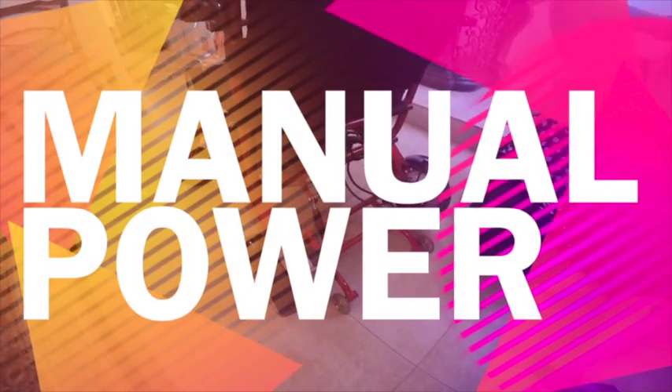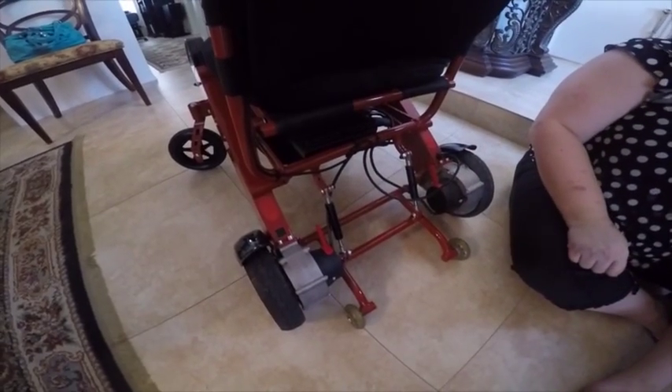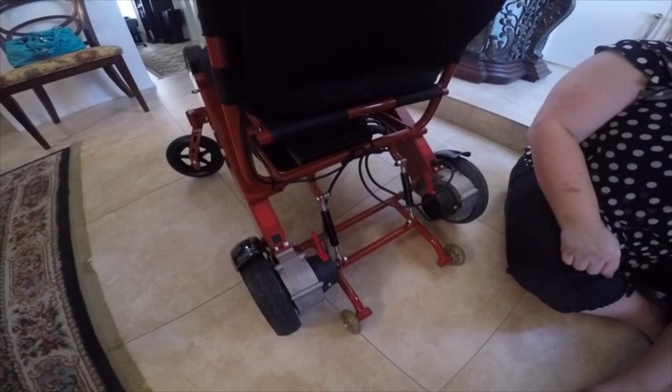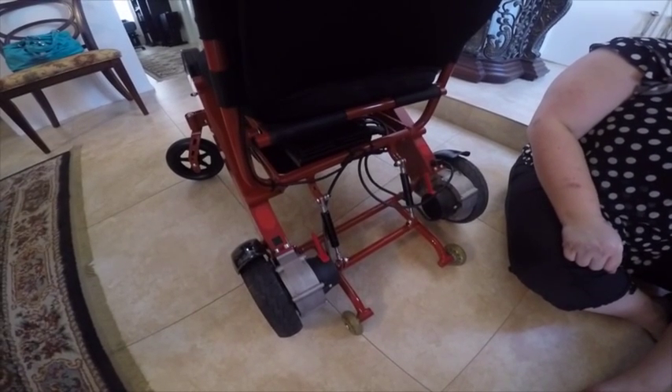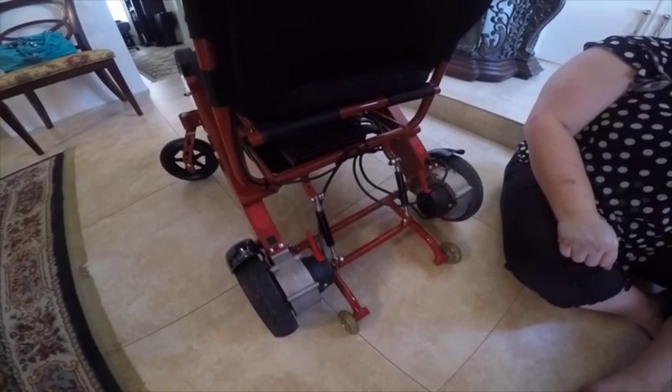In this video we're going to show you how to disengage the engine. If you're out and about and the battery goes dead and you need to turn your power wheelchair into a manual wheelchair so it can be pushed, this is how you disengage the engine from the wheels.